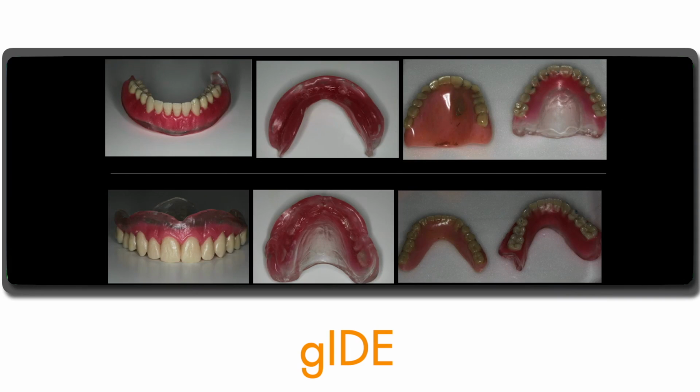So you can see the difference in the prosthesis. You can probably see, particularly in the mandibular prosthesis at the wax try, a completely different periphery, different borders of the denture, and this is engaging now. The new prosthesis has to engage the primary stress-bearing areas. So that buccal shelf retromolar region is a very important area to engage, and the previous prosthesis was not fitting so well because it wasn't really a well-fitting tissue-bearing denture.